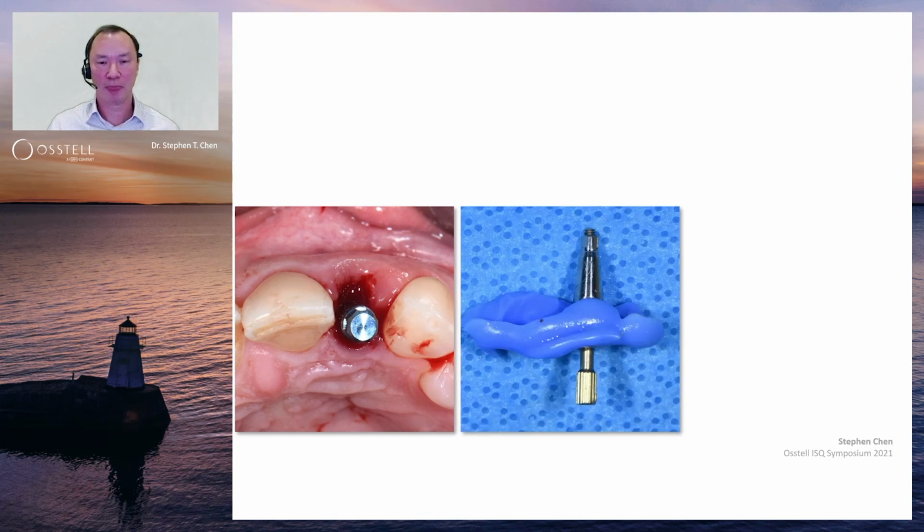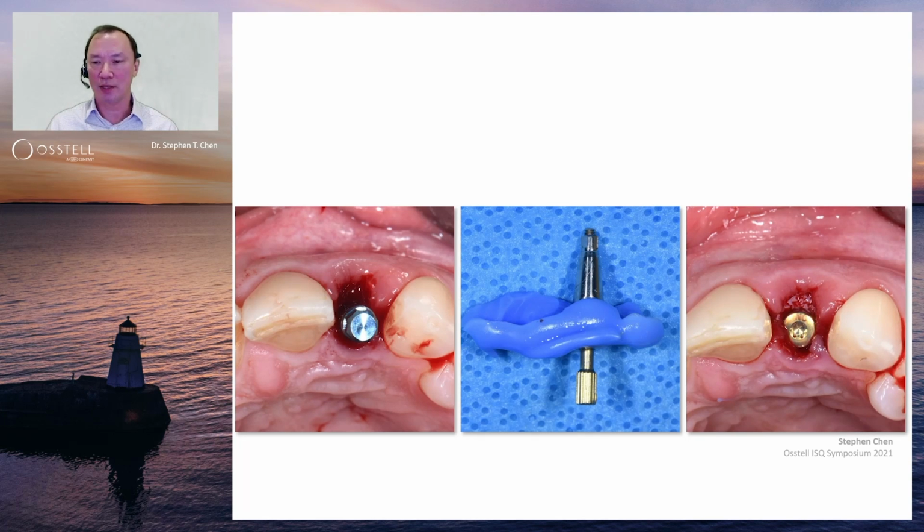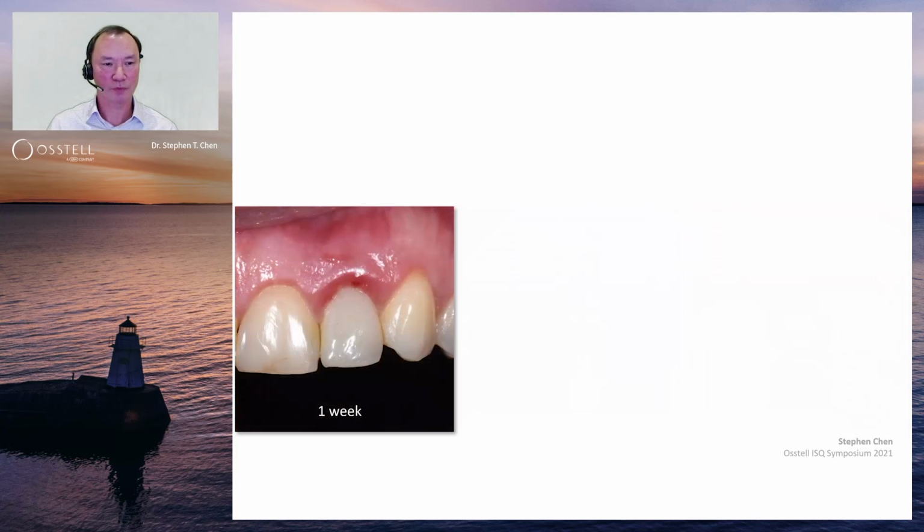the shoulder. Now, at this stage, this was done some time ago, and this is a conventional approach. So we've taken an index of the implant, and once that's done, then the buccal defect has been grafted after the healing abutment has been connected. So you can see the completed procedure. And this is an immediate loading protocol.